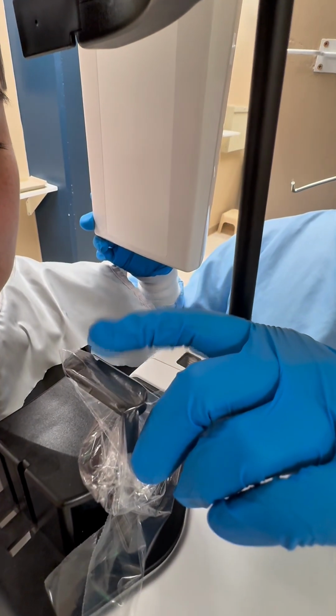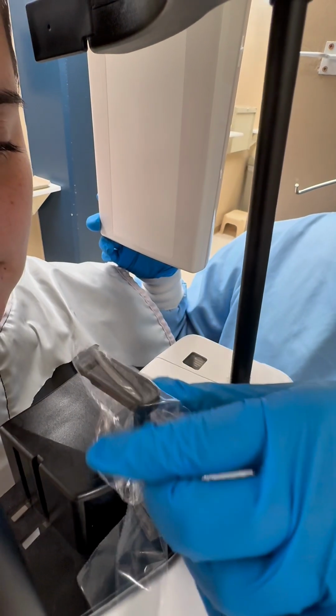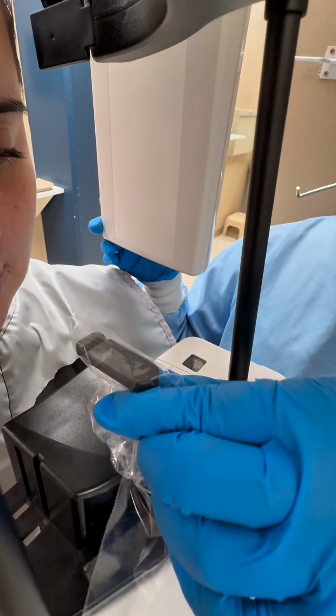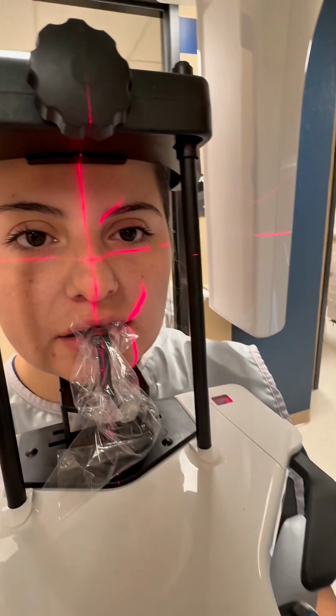Position and adjust the bite block. Teeth must be placed in the grooves on the bite block. For edentulous patients, place a special block under the patient's lip into the mental. Turn on the light by pressing the light bulb button.